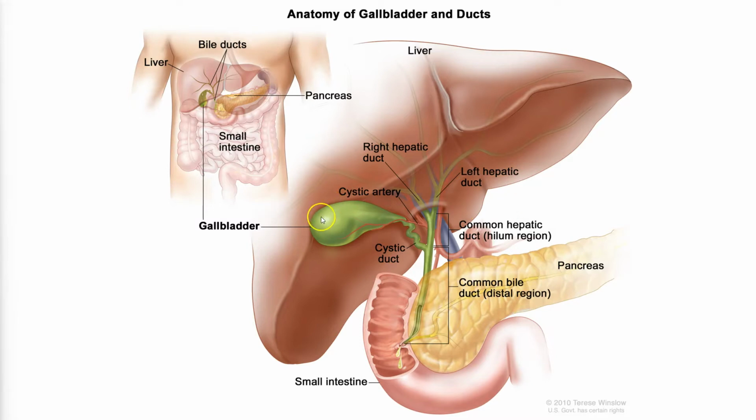And then as you're going through this entire approach, really your approach is going to be to look at the ultrasound, to look at the gallbladder in a couple of different axes and answer those clinical questions. First and foremost, when you're putting the ultrasound probe on, you have two approaches. You come up lateral, here in this right upper quadrant view, and you'll look in from almost this window. So you'll be peeking in from here and getting a view of the gallbladder from this side. Or you can look anteriorly and put the probe on the front of the abdomen, and basically your probe will lie right over the gallbladder, and you could look at it in short and long axis. We'll talk through what those are one more time momentarily.